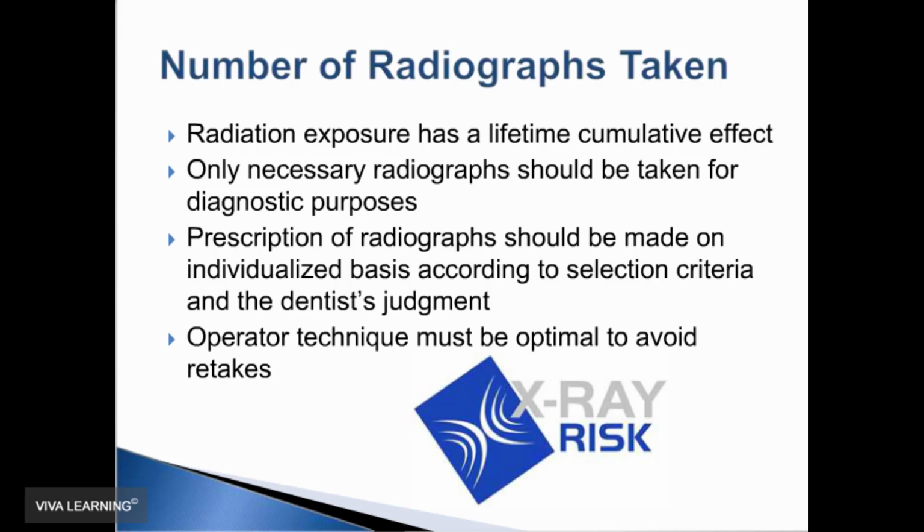So it is important to make sure that radiation is kept to a minimum. The prescription of radiographs should be on an individualized basis, as we just discussed, according to selection criteria, and we will be careful in our technique to avoid retakes.